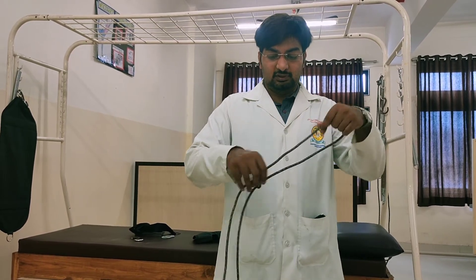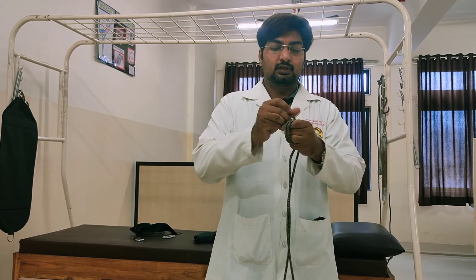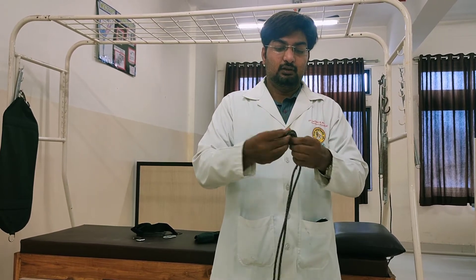This is the actual rope and how it looks — this is the full rope. You can just tie a knot in between and divide the rope.